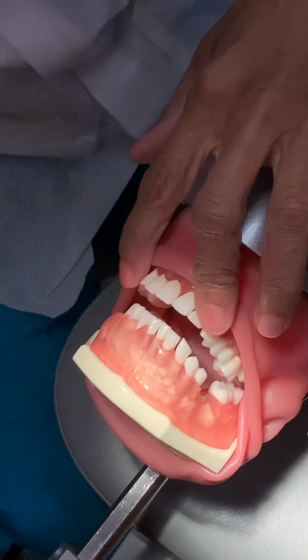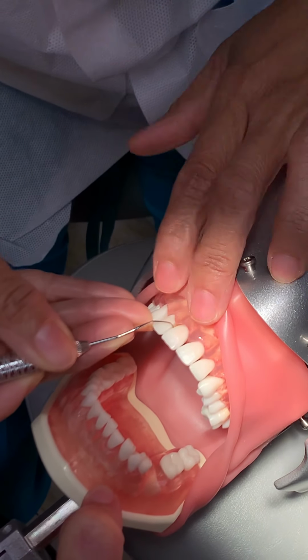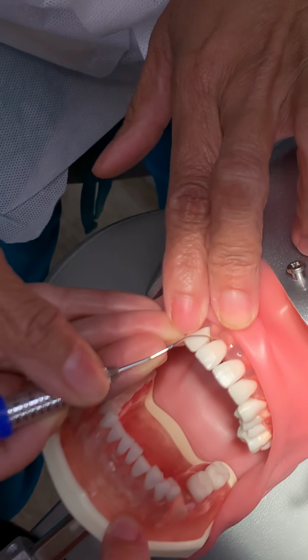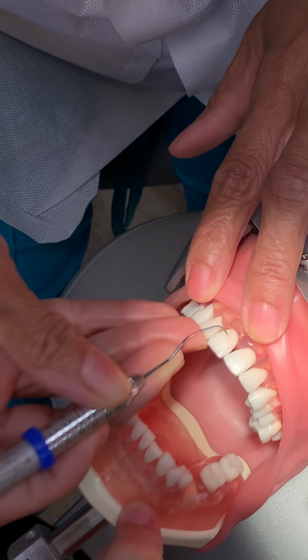And when we're on the anterior teeth, instead of your terminal shank being parallel, once you get in approximal, your terminal shank is across the tooth, as she talked to you about yesterday. Get ready zone, tip third, sit up to the gum line. Go all the way down in the proximal.